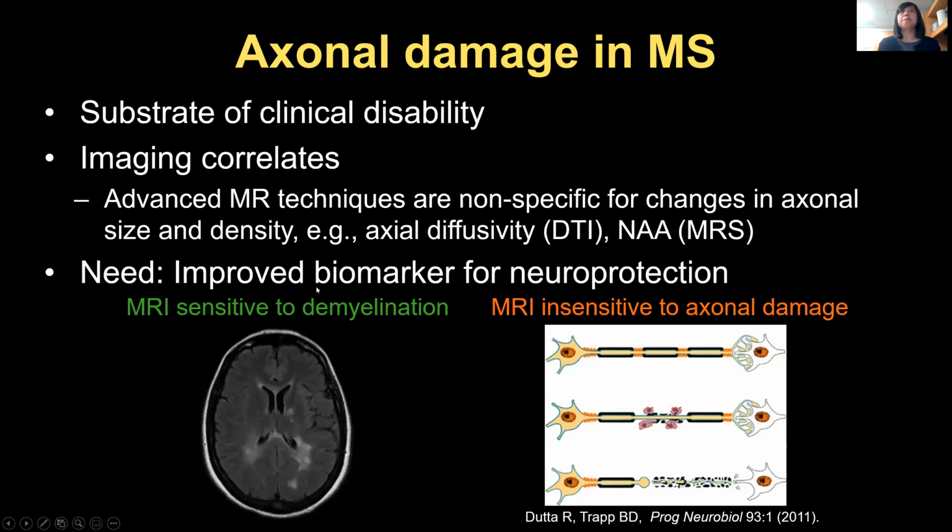So a common clinical dilemma that we see is that in patients with MS, it's very easy to identify these demyelinating lesions on a FLAIR image. And when you image patients over time, they may accumulate lesions, especially in the more inflammatory phases of the disease. And then for the progressive phase, you'll see that the lesion burden doesn't change, but the brain volume starts to shrink.